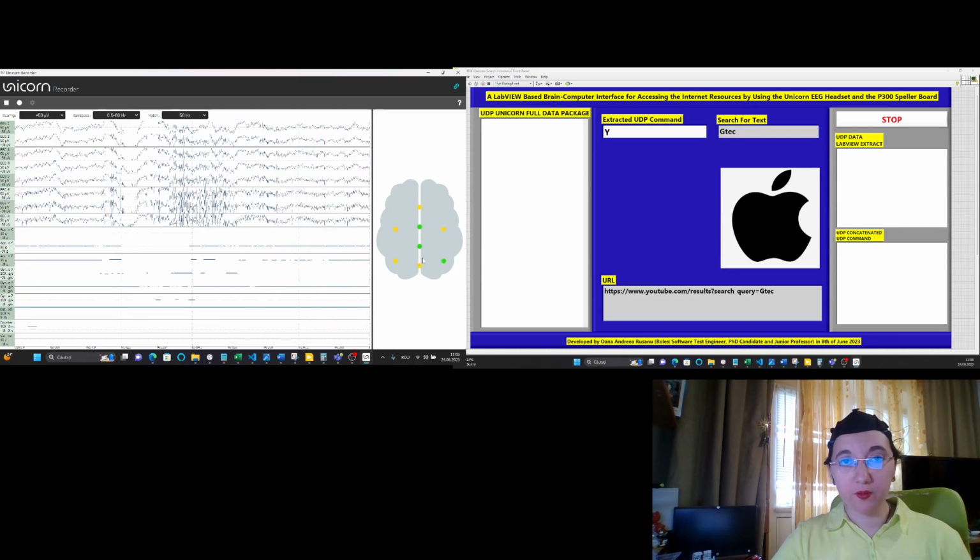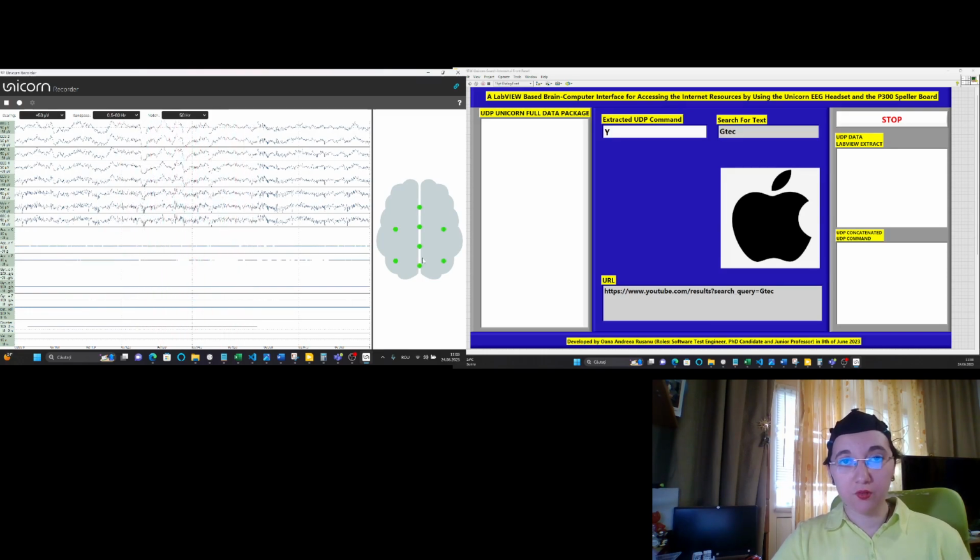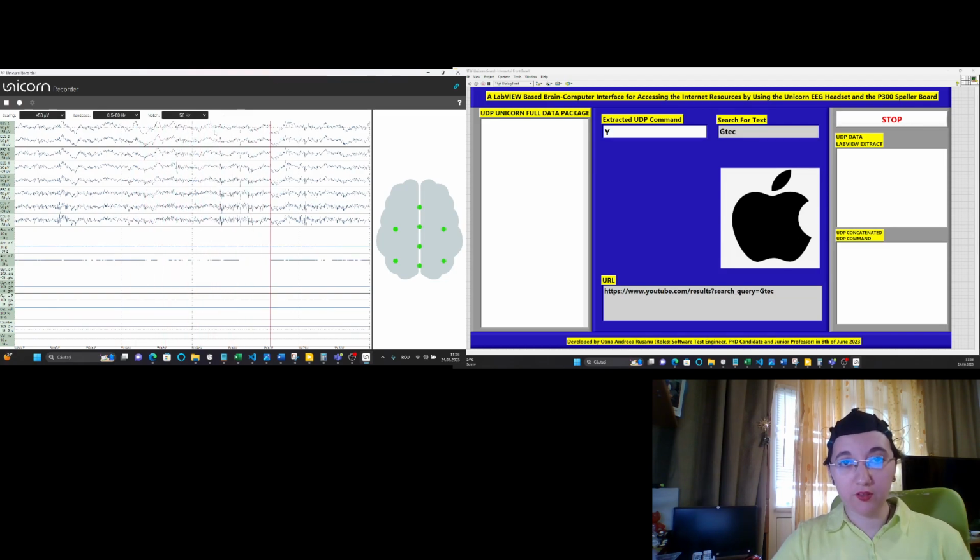So during the experimental session, I will avoid the body movement, and also I will try to speak less. Now I will close the Unicorn Recorder application. I checked that the EEG quality is just perfect.